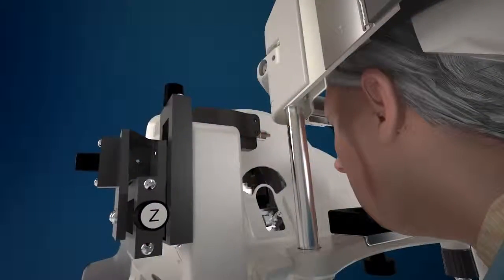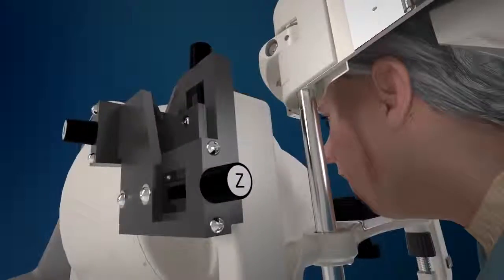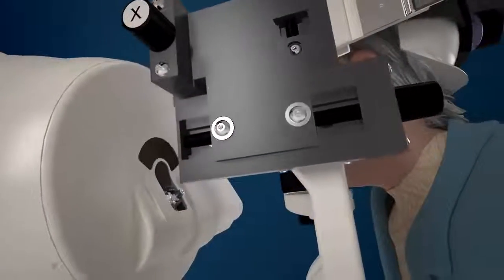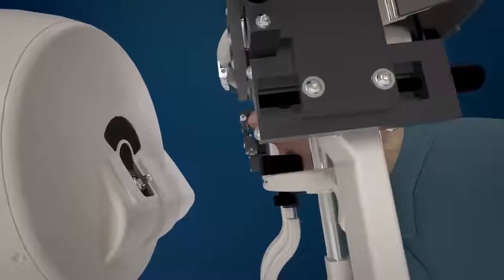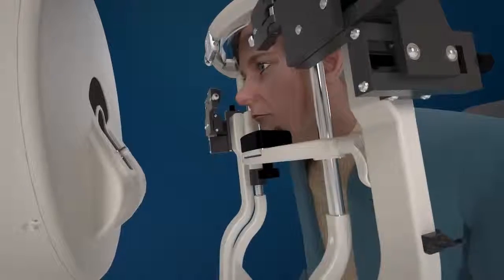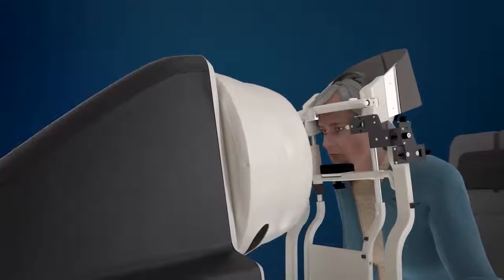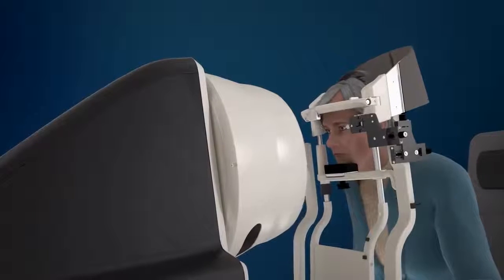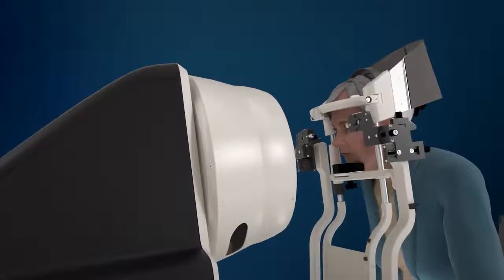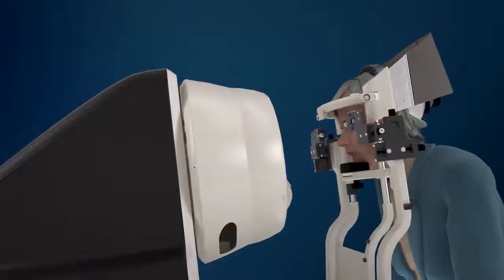The Oraya therapy is an innovative treatment for wet age-related macular degeneration. The Oraya IRay system is a stereotactic radiotherapy device that delivers low-energy X-rays to inhibit and prevent the choroidal neovascularization associated with wet AMD. There is evidence to suggest that ionizing radiation has an anti-angiogenic and anti-inflammatory effect in conditions such as choroidal neovascularization.